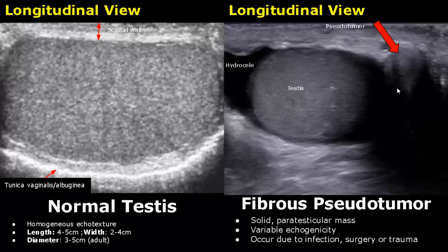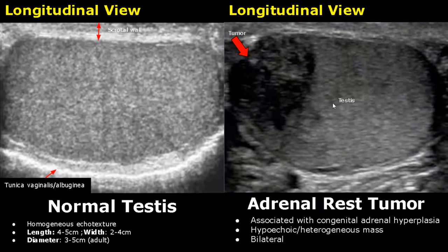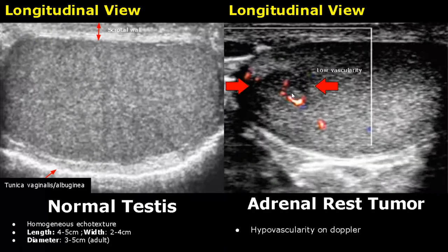Adrenal rest tumor is associated with congenital adrenal hyperplasia. It is bilateral and usually appears hypoechoic or heterogeneous. Here is a Doppler image of adrenal rest tumor — it shows low internal vascularity on color Doppler.